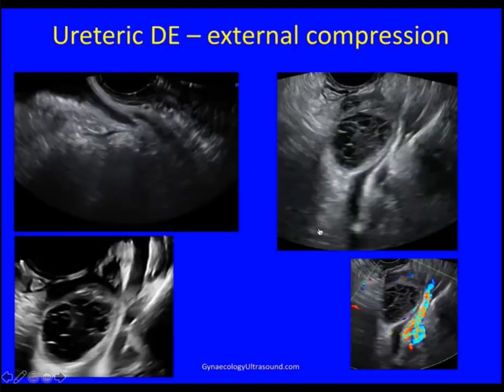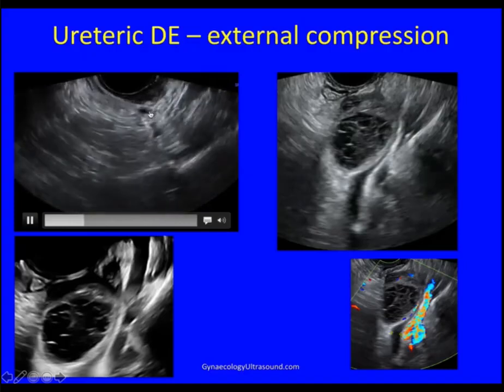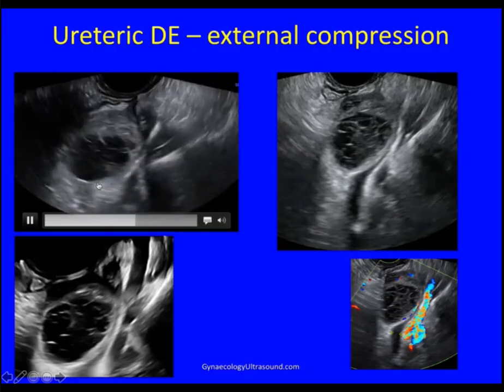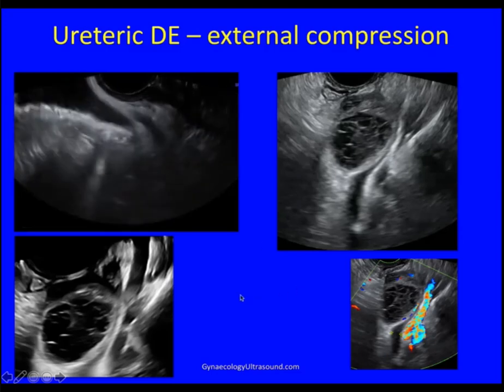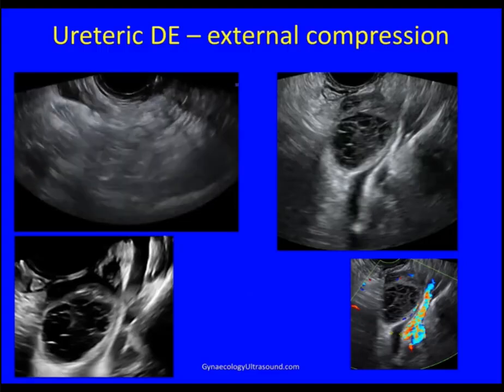So now you know what normal looks like. This is the ureter. I'm following it up. Quite tricky. You keep losing it, following it. Looks normal, normal, normal, normal, until we get to the ovary. And now I'm going back, following that ureter back up there. But that lower ureter is normal between the bladder and the ovary.